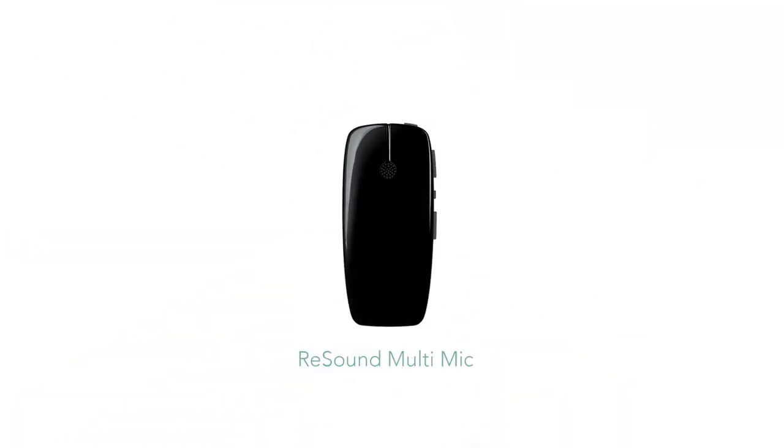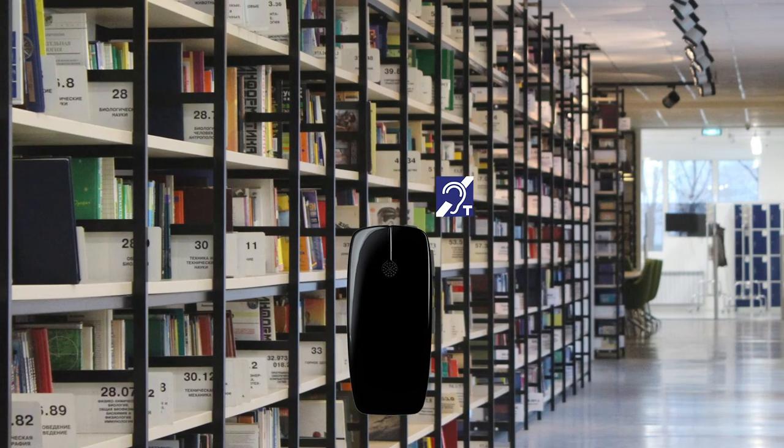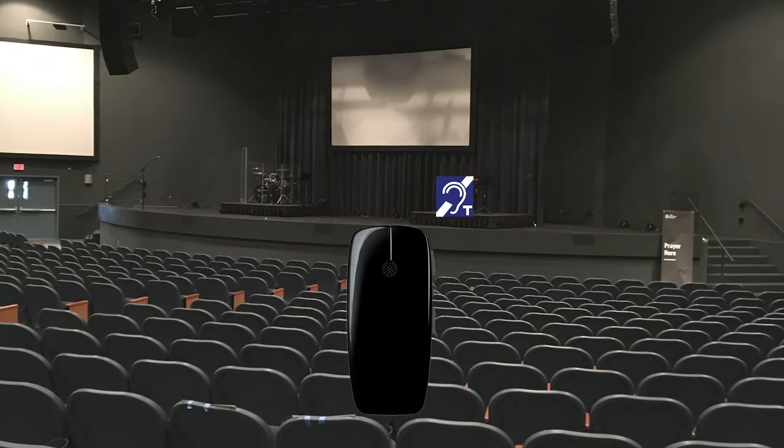The ReSound Multi Mic is a powerful microphone accessory that can be used to stream audio directly into your hearing aids. It can be used for one-to-one conversations when worn by another person on their shirt or lapel, and has the ability to minimize background noise so you may focus on the conversation with greater clarity. In a group environment, you can place the mic on a table to pick up on multiple speakers. The accessory can also function as a third-party supporting device to pick up on telecoil or PA systems in venues such as public libraries, museums, art galleries, or movie theaters.